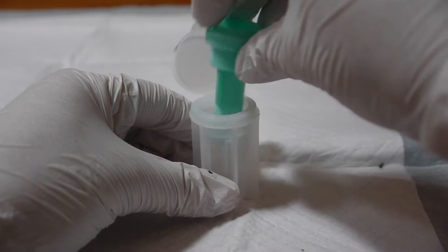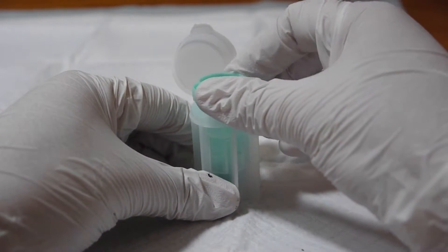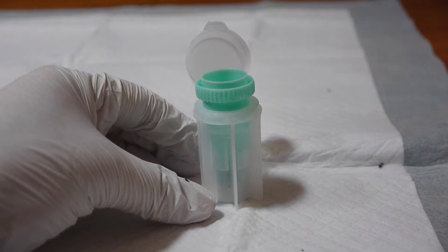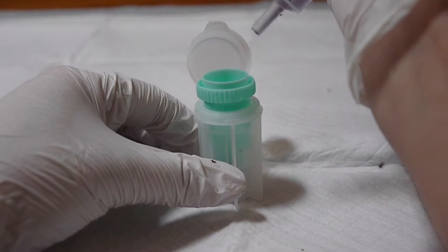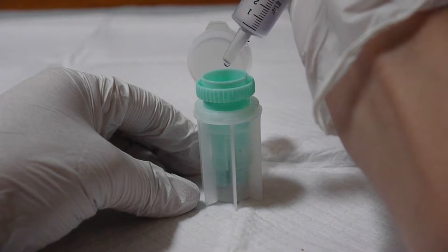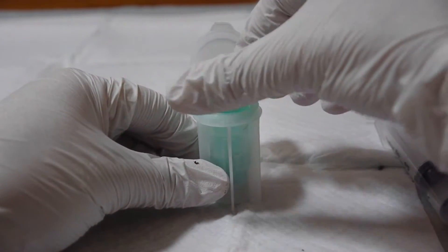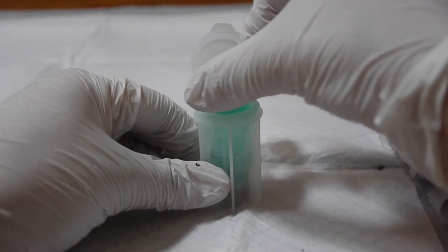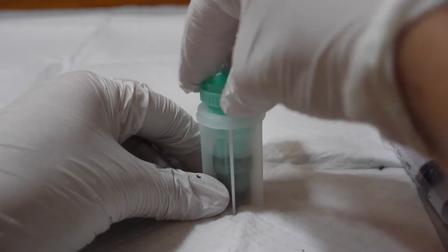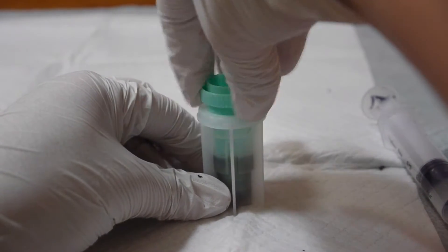Place the center piece back in the fecalizer but do not push it down tight — make sure it can still twist freely. Next, pour some fecal solution into the fecalizer about halfway. You can use a syringe, eyedropper, or a bottle with a flip lid to make the solution easier to control. Agitate the solution by turning the center piece side to side like a washing machine so the sample breaks up and mixes with the solution.